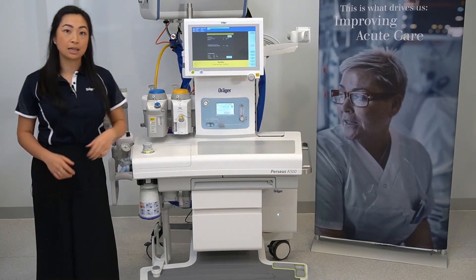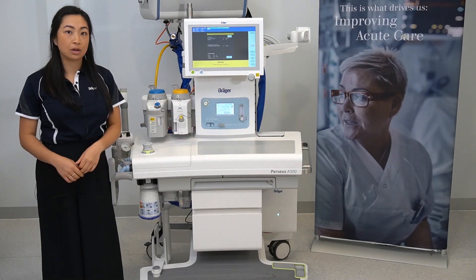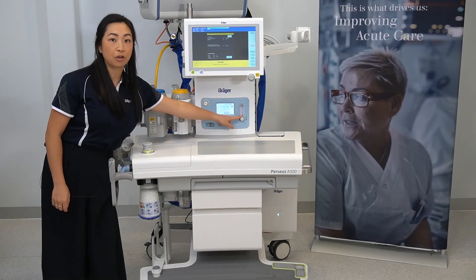This is the alarm silence button. Here is the electronic mixing unit, the oxygen flush button, and the oxygen flow meter.